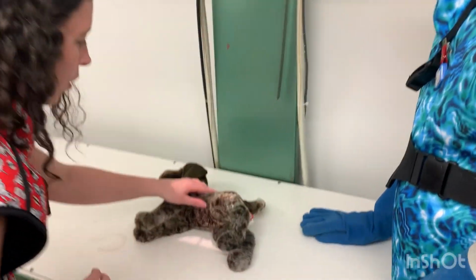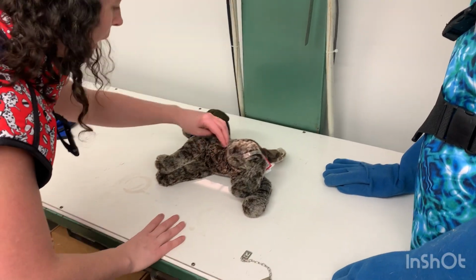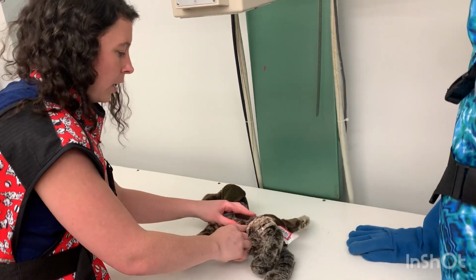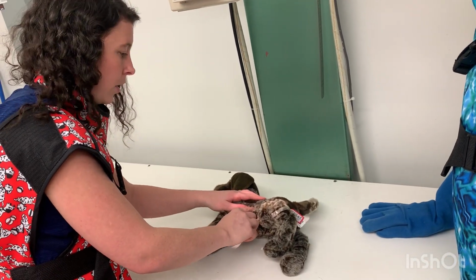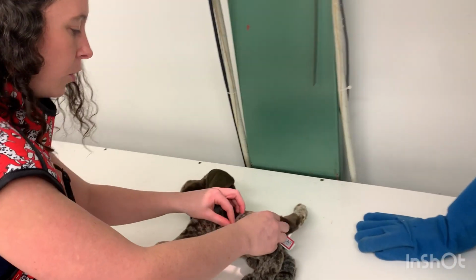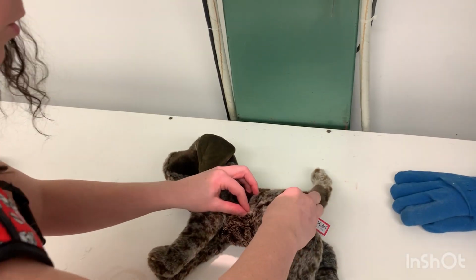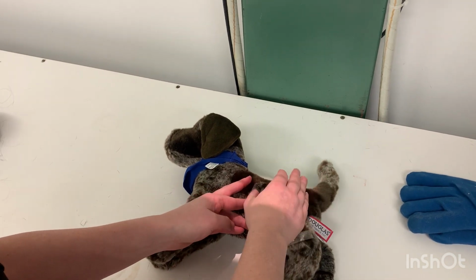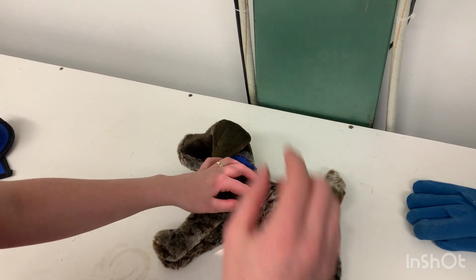So our markers here are going to be at our 8th rib. So we would count backwards, start at your 13th, count up 12, 11, 10, 9, 8, get to the point there. And then you need to make sure, so you feel the rib, and then get to the greater trochanter, which is the point of the hip, and that's the area that we need in. So that would be our collimation field, essentially.